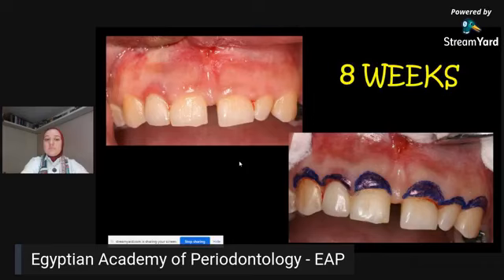So what we have right now, as you can see here, is a minimum scar formation after the frenotomy procedure after 2 months or 8 weeks. And you can see that the frenum does not represent a problem for you anymore. And you can start with your static crown lengthening, avoiding the frenum pull that was here. And you can see that we don't have a huge scar in between the centrals.